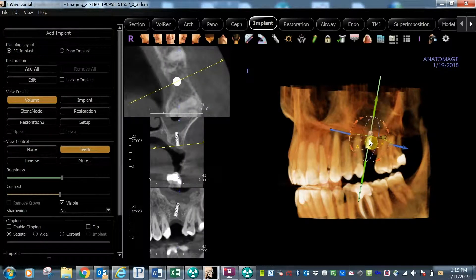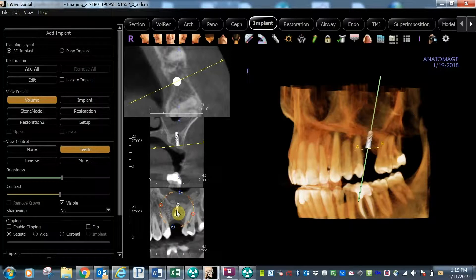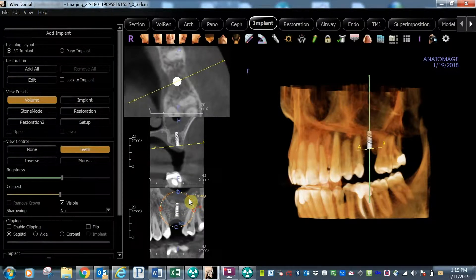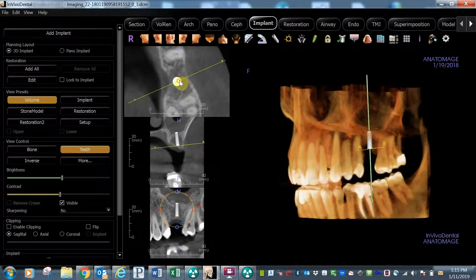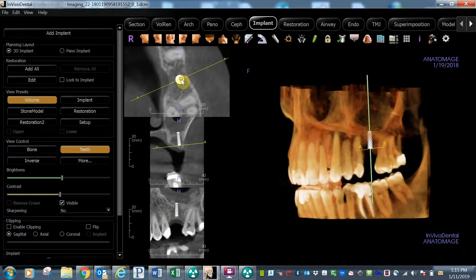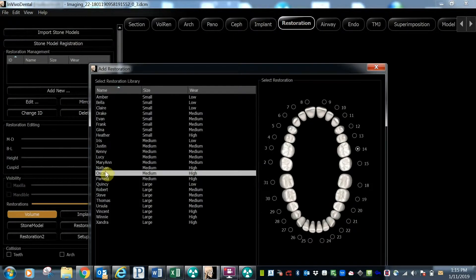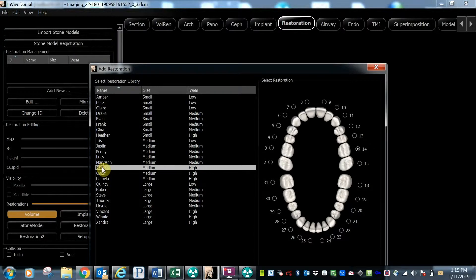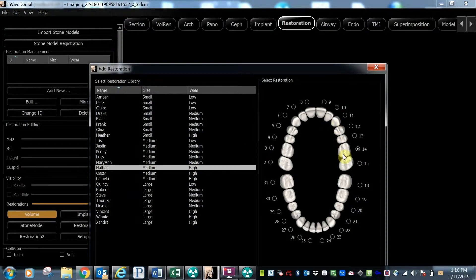In this view, you can adjust the implant as needed. When your implant is positioned correctly, select the Restoration tab. You will then be given the option to select a tooth from a generic library of sizes and wear patterns. The tooth number will be automatically selected.